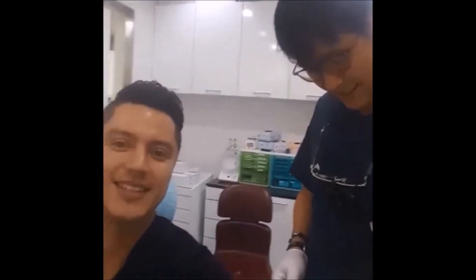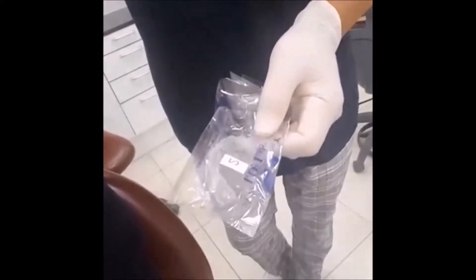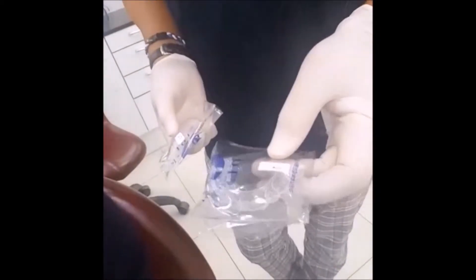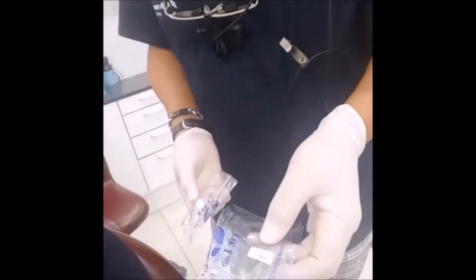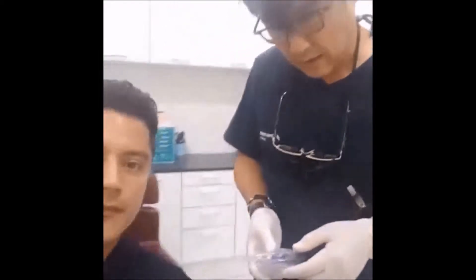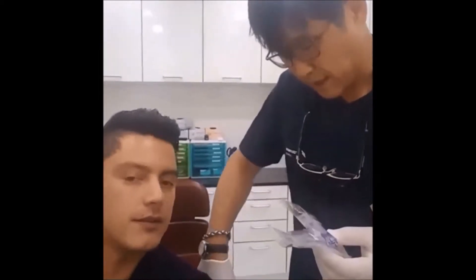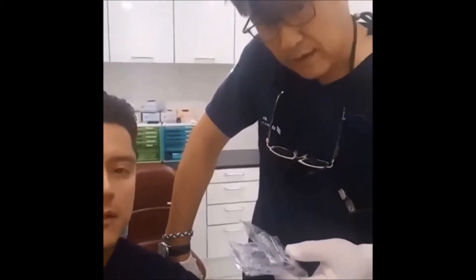Hi everyone, I'm here with Dr. Bae. So my clear aligners are ready. See this tooth? For the two appliances, one is for one week and the other one is for two weeks. So it starts from the soft one. This is the number one appliance. Every session we need two appliances, so the total is for three weeks. These two appliances are for three weeks of working.